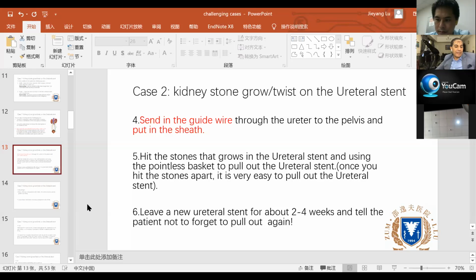Professor Yasser. Yes, please. Regarding the parapelvic cyst and the stone, which he already showed us, he made a window between the parapelvic cyst and the pelvis, and he attacked the stone, and then he left the DJ stent in the cyst. Actually, this is a procedure where we expect that some of the fluid will extravasate outside, and he just left the DJ stent. I cannot imagine it. Is it a well-established way of managing the parapelvic cyst and the stone? Usually what I know is they do it by PCN, percutaneous surgery. I cannot imagine just leaving a stent.